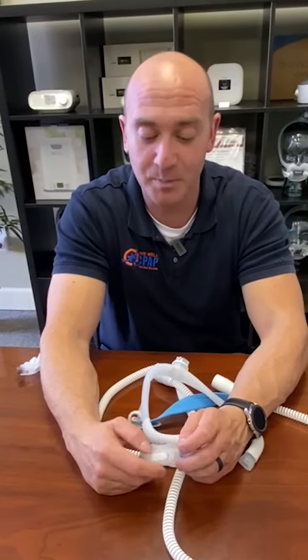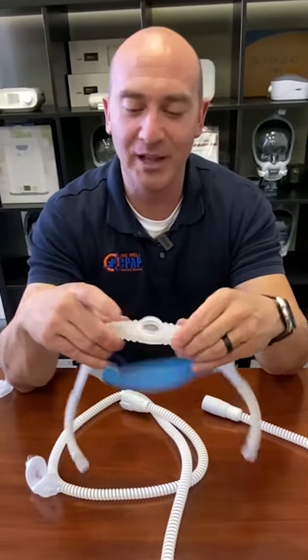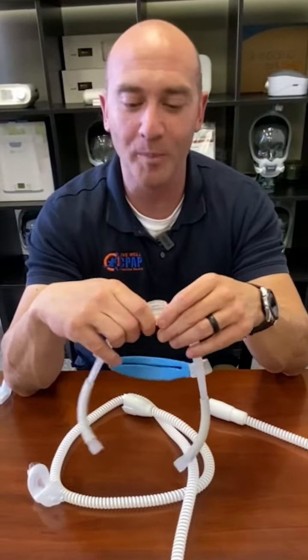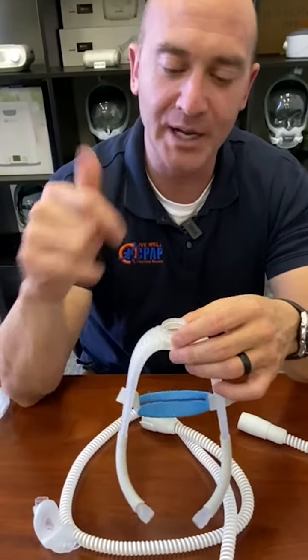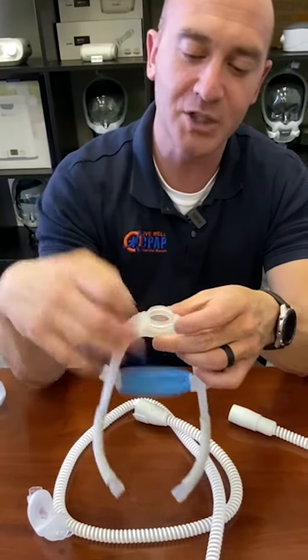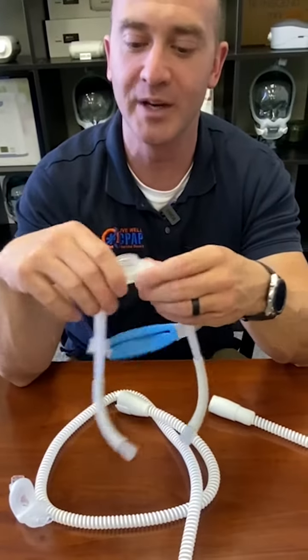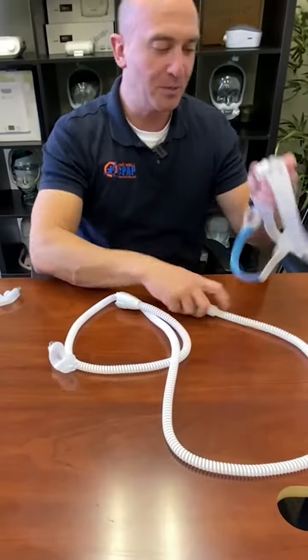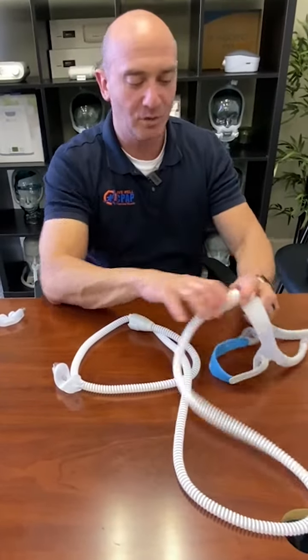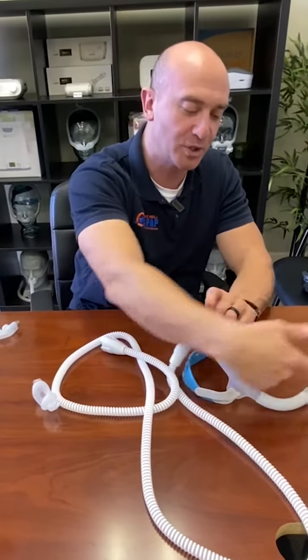Taking it off is pretty simple — you can just grab it and pull it up and off. If you grab and pull, it will pop out. You want to clean this as close to daily as you can. You can use CPAP wipes or baby wipes, but you want to get most of the oils off. If there's an oily film on there, it won't seal up like it should. You can see how flimsy that membrane is — it's designed to blow out and grip your nose when it has air or pressure in it.